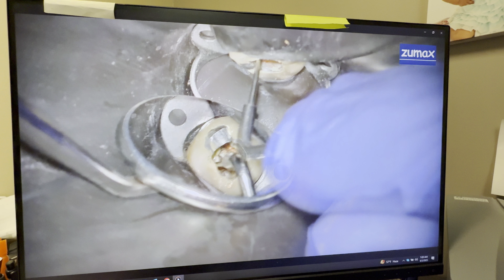Number 15, I removed the bulk of the gutta percha with chloroform and number 15 C file. I'm topping off the chloroform, and now I'm going in with a number 10 C file attached to my reciprocating handpiece that I'm running at 1000 RPM, torque off. I'm trying to go to my estimated working lengths.